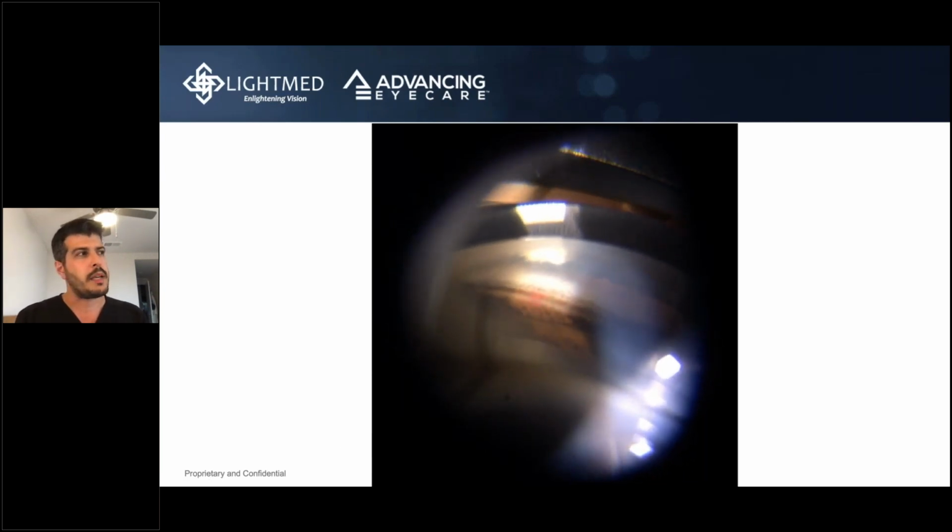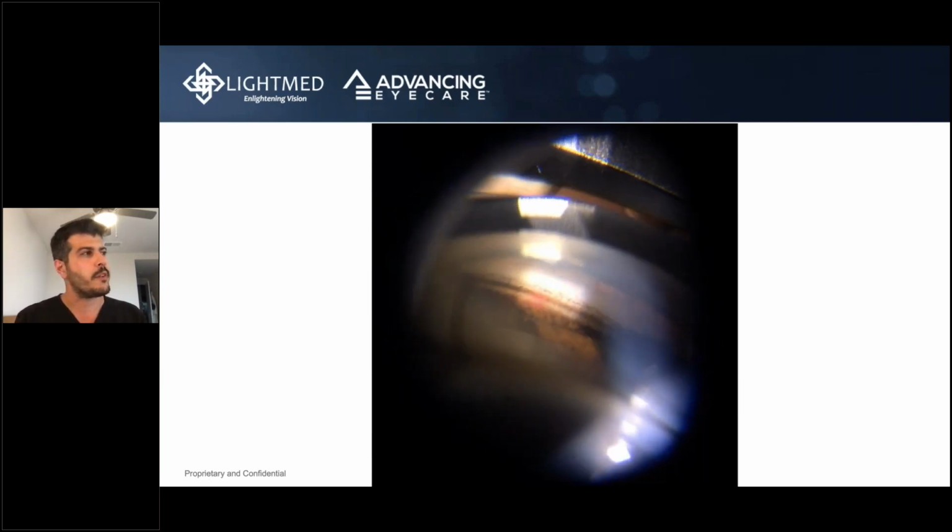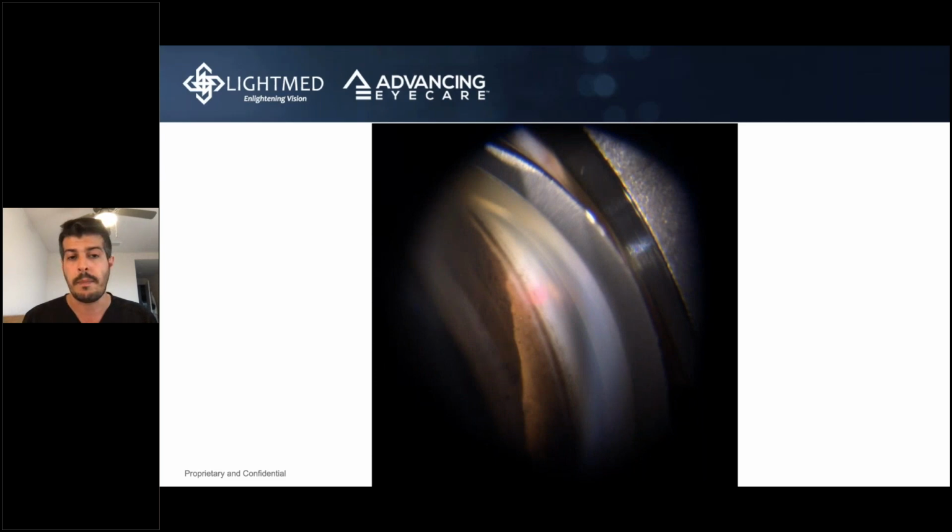I guess the best way I can answer that is when I was a first-year resident, my senior resident showed it to me once, and that was it. So after that, the expectation is you're going to know how to do it. I would say just like MIGS surgery, the surgery part is very easy. Same with this. I mean, you're basically clicking on the SLT machine and it applies it. The trick is the angle visualization. If you have good visualization, it's going to make everything easy.